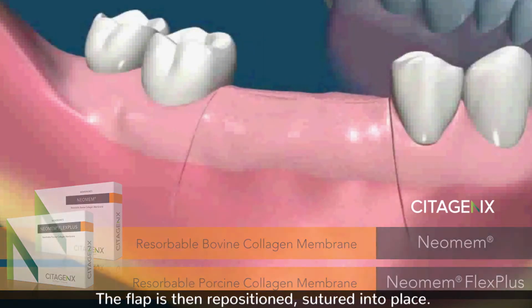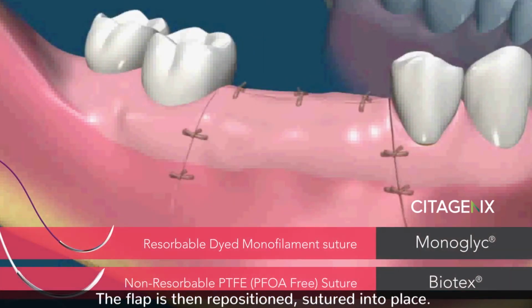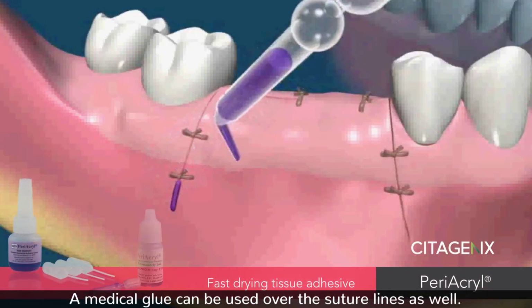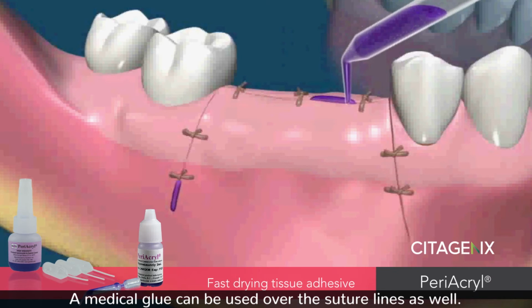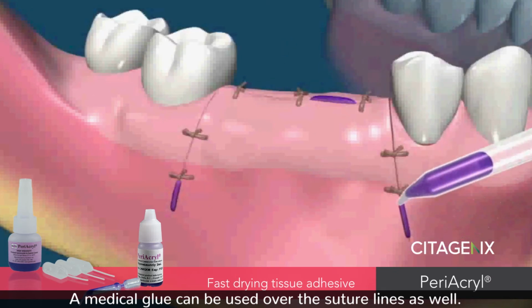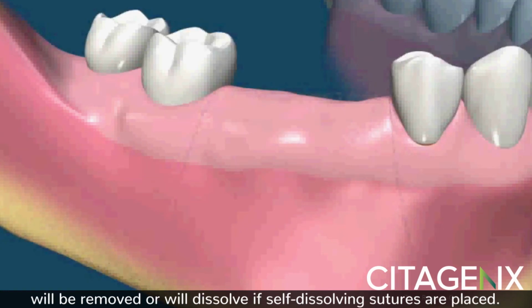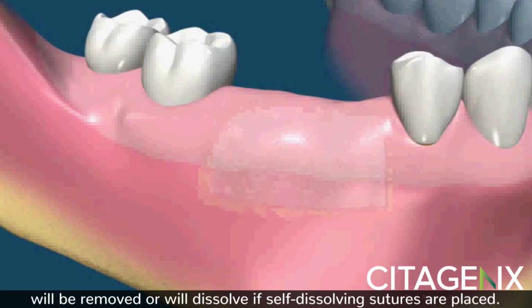The flap is then repositioned and sutured into place. A medical glue can be used over the suture lines as well. The area is then allowed to heal for a period of time. The sutures will be removed or will dissolve if self-dissolving sutures are placed.